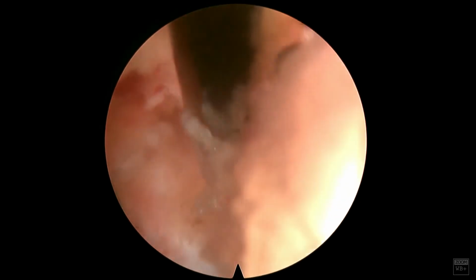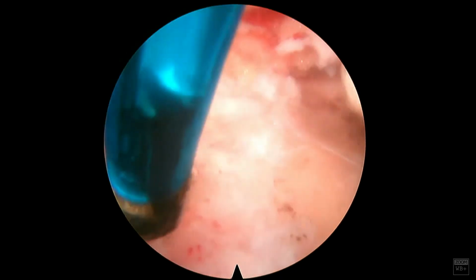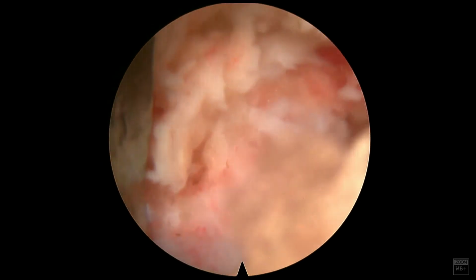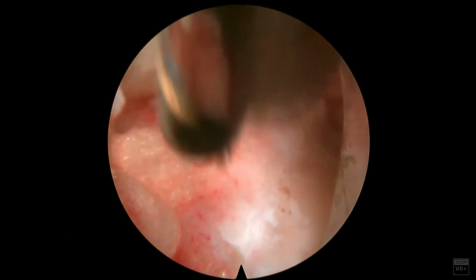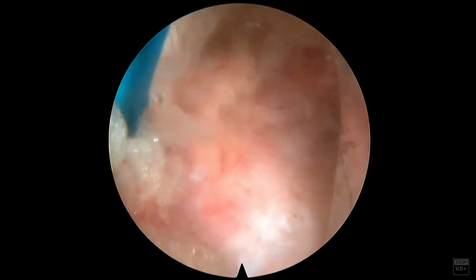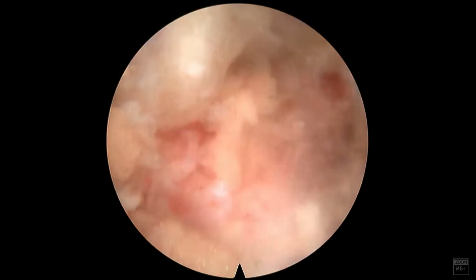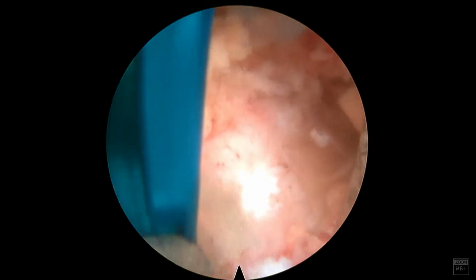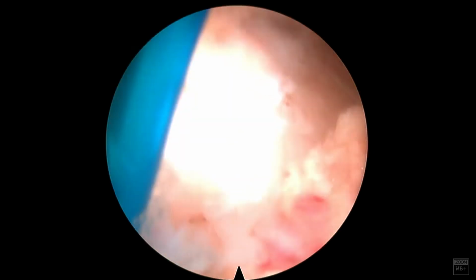Again, I don't know if you saw a hint of the exiting L5 nerve root there on the side. That's the nice thing about the Joymax cameras, you can really see it. And if you look here, I finally was able to figure out the disc space. It's calcified. I'm removing some of this fat, but if you saw, I could press with the RF probe, and the annulus was moving a little bit. It's still a little bit spongy, but definitely a calcified component over it.